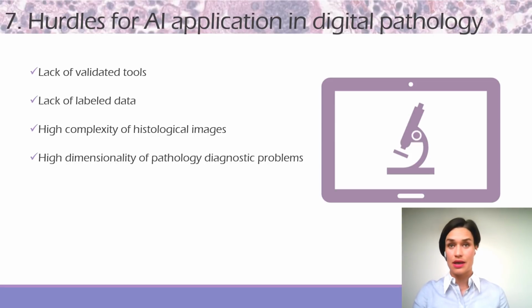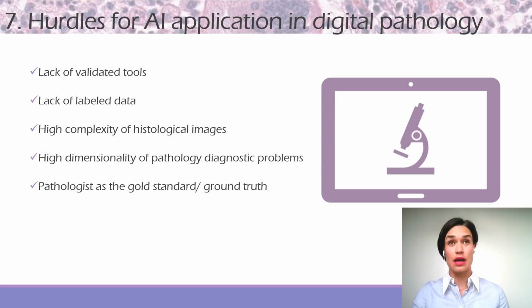There is a different pattern recognition involved, and incorporation of many different processes visible on the slide and different data available about the patient. Another problem or a hurdle is that pathologists are the gold standard, or they are generating the ground truth. So the algorithm can only be as good as a pathologist. And also pathologists tend to differ.